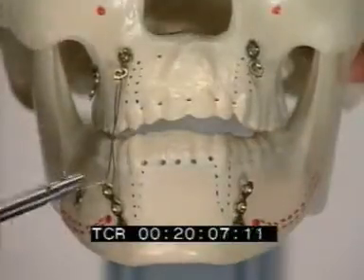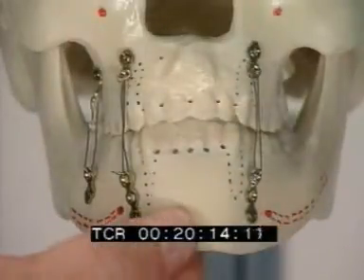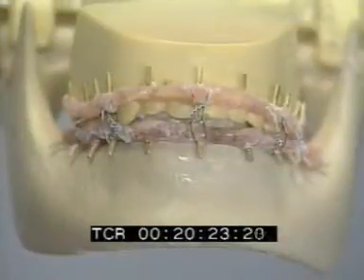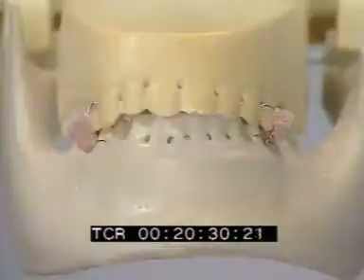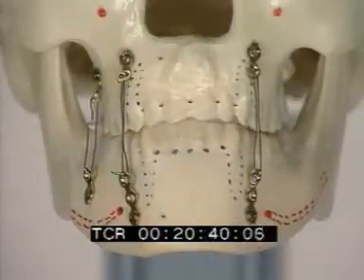After establishing the occlusion, mandibulomaxillary fixation is done with 0.4 millimeter wires. Here, too, there may be a lack of stability because of the elasticity of the long wires. To summarize, arch bars are still the first choice due to their universal capacity in all indication categories. In emergency cases and certain individual indications, Ernst ligatures, IMF screws, and plates and screws can be an alternative.